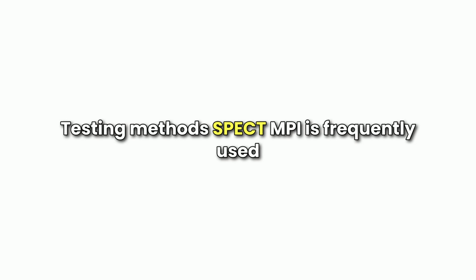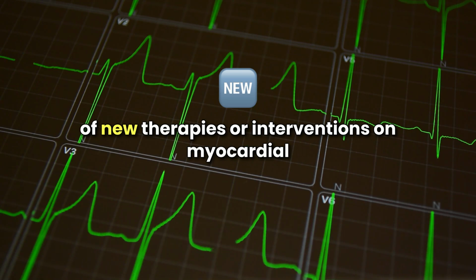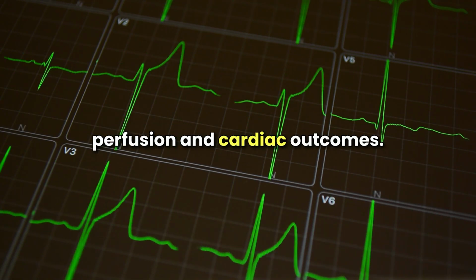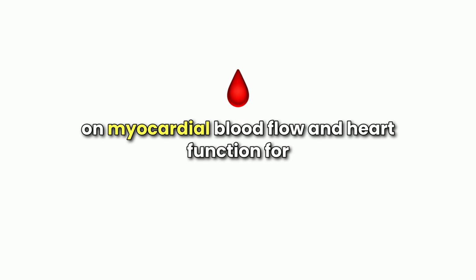SPECT MPI is frequently used in clinical research to study the effects of new therapies or interventions on myocardial perfusion and cardiac outcomes. It also evaluates the impact of investigational drugs on myocardial blood flow and heart function.